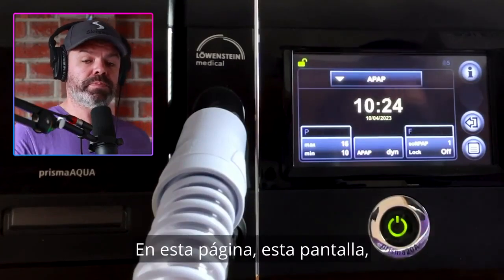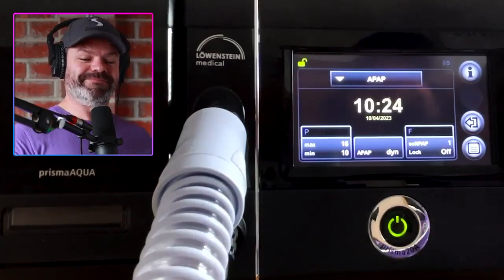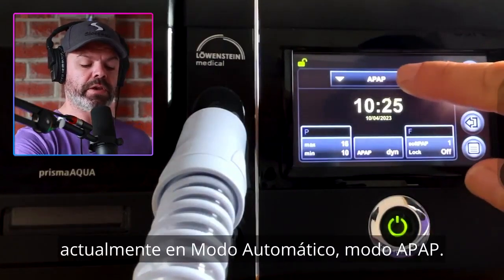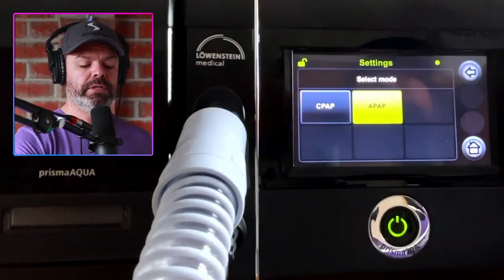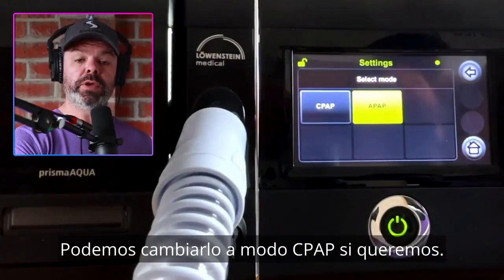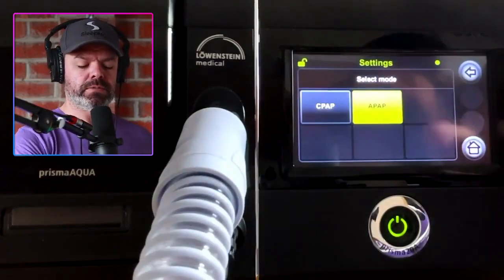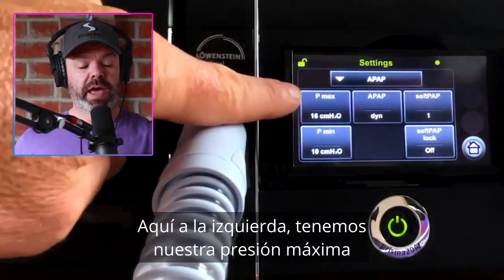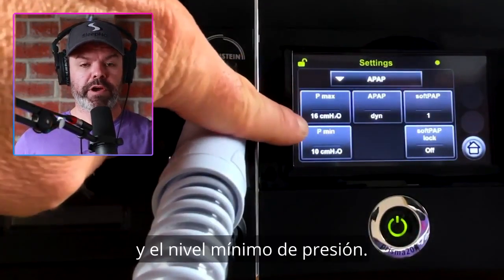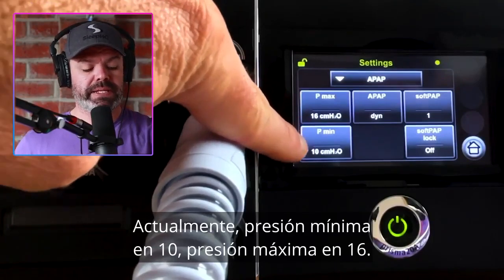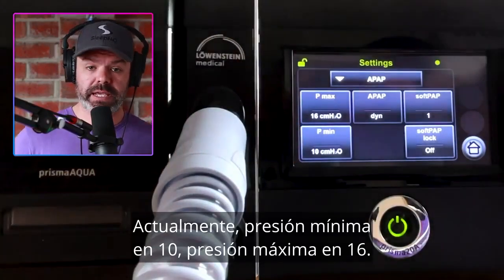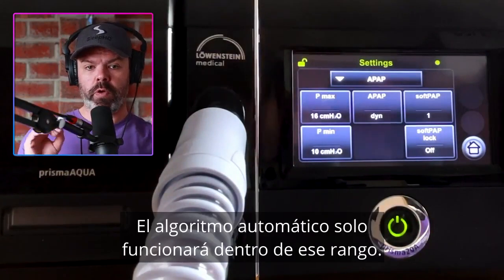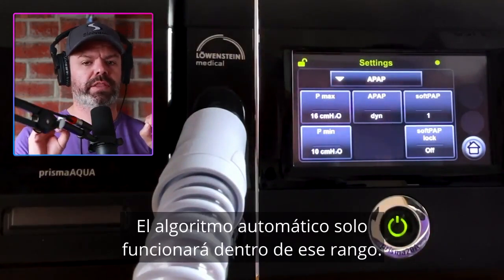On this screen we can change the therapy mode up here. Currently in automatic mode — APAP mode — we can change it to CPAP mode if we like. Over here on the left, we have our pressure max and pressure min level, currently pressure min at 10 and pressure max at 16. This is the therapy range. The auto algorithm will only work inside that range.